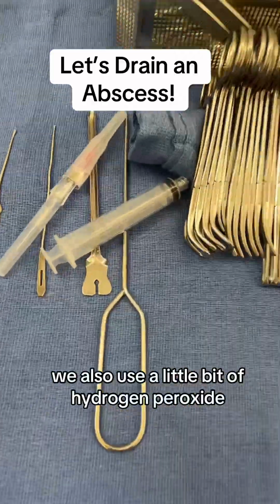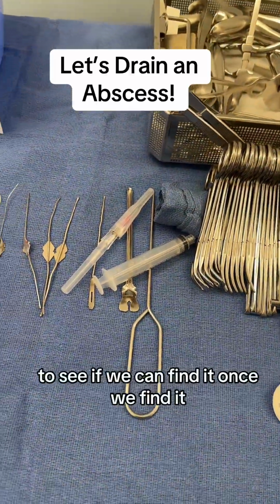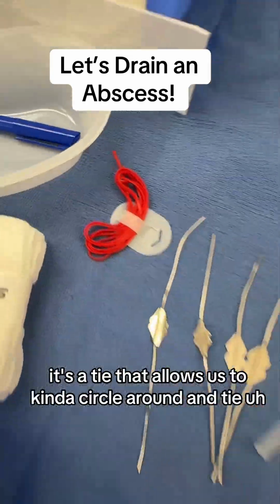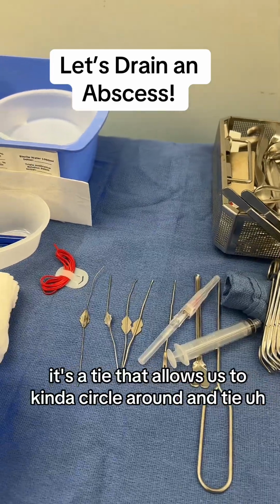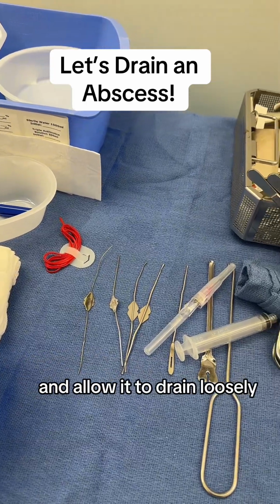We also use a little bit of hydrogen peroxide that we inject through a little catheter into the fistula to see if we can find it. Once we find it, then we use a seton. This is a little vessel loop. It's a tie that allows us to circle around and tie a rubber band around the fistula and allow it to drain loosely.